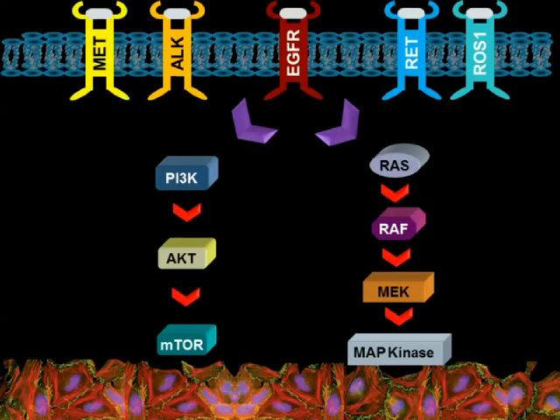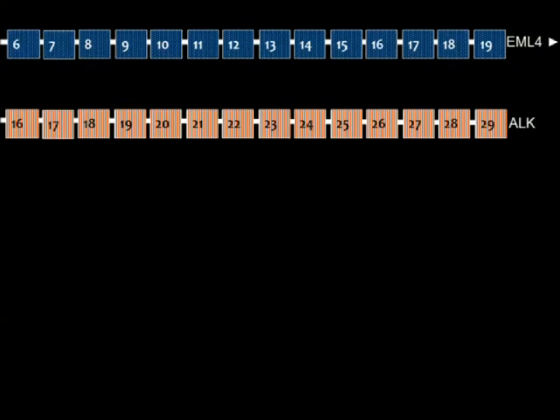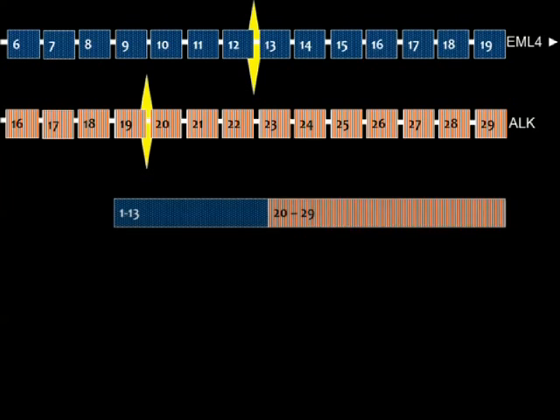Using capillary electrophoresis, this is a very, very strong way to look for a mutation that you know and that's very specific. The advantage of allele-specific PCR is actually quite significant when it comes to sensitivity, because allele-specific PCR is actually more sensitive than Sanger sequencing. You don't need a 20 to 30% tumor ratio for allele-specific PCR. You still probably need a 5% tumor ratio, so it's not perfect. It certainly is not as sensitive as you would want for something like minimal residual disease or something where you're looking for rare tumor cells.